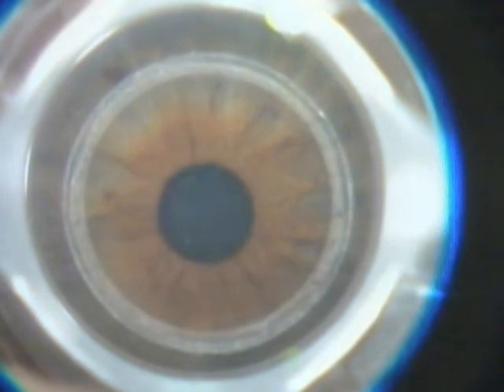The technique begins with a lamellar cut with femtosecond laser with an external diameter of 8.5 or 8.75 millimeters, but without making the cut in the middle 3 millimeters corresponding to the visual axis. This cut with the femtosecond will give us sufficient depth for the lamellar technique, which is 100 microns from the endothelium to the surface.